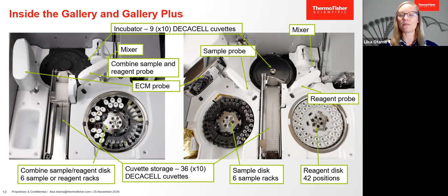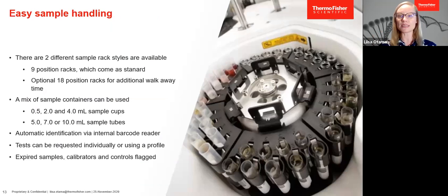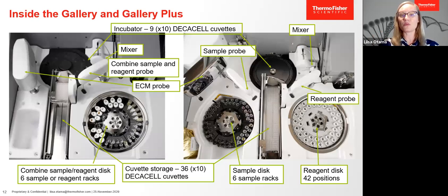We have separated sample and reagent probes on the Gallery Plus. And otherwise, it's very similar. So the same ECM option is available also for the Plus model.